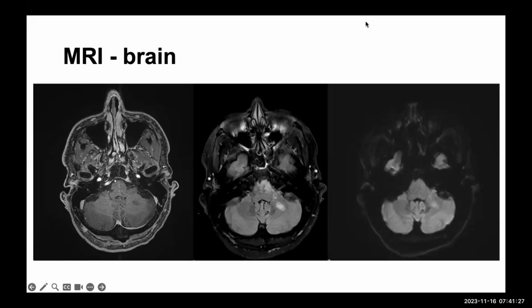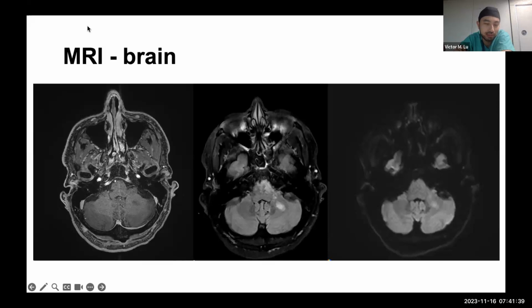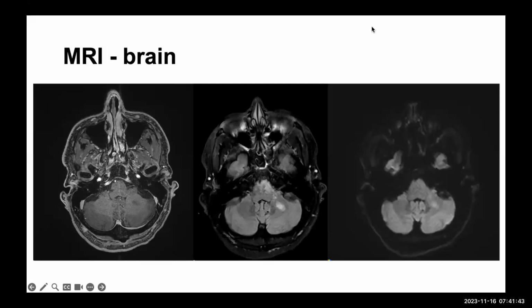And then on the restriction, I don't see any. Let me see if I can change the lighting, go down a bit. It's not that much, if anything. Okay. Yeah, nothing. It's nothing that jumps out at me right now. Knowing where the lesion is, I can actually see some, but very minor.